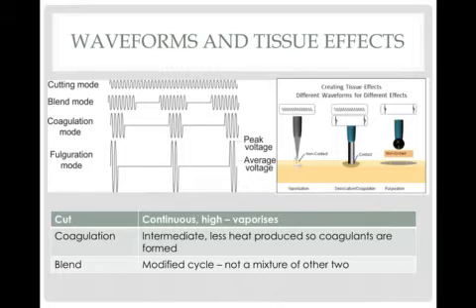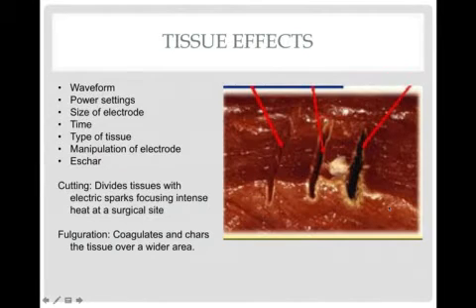So you need contact with the tissue in order to achieve coagulation. And then you have fulguration. As you can see here, the diathermy is applied in a wider area with fulguration. If you think, for example, that you have taken the gallbladder off the liver bed and there is generalized oozing, you might want to consider using again this non-contact waveform to achieve diathermy.